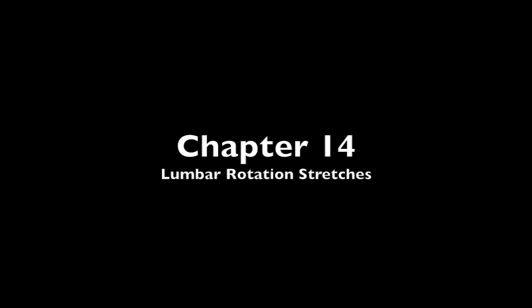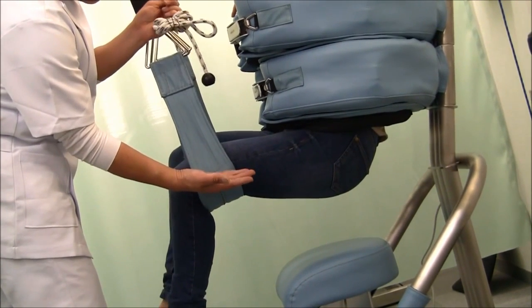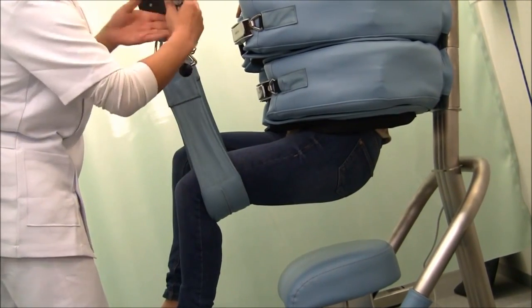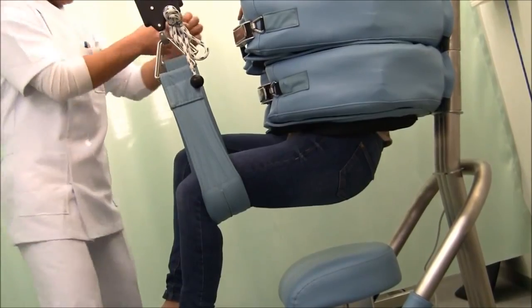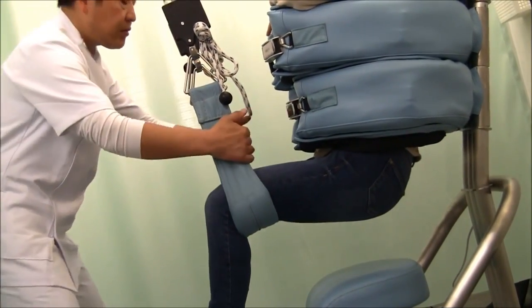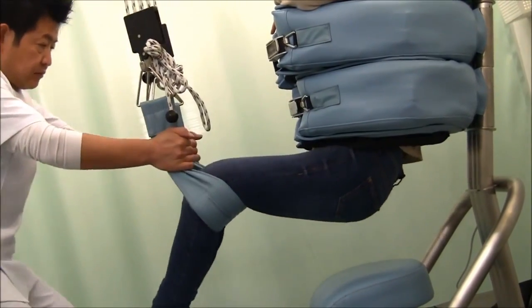Chapter 14. Lumbar Rotation Stretches. Have the patient with their knees bent and apply clockwise and counterclockwise rotational pressure while using anterior and posterior force. Adjust their height so that the patient is comfortable. Increasing and decreasing the height of the leg will focus on different muscle groups.